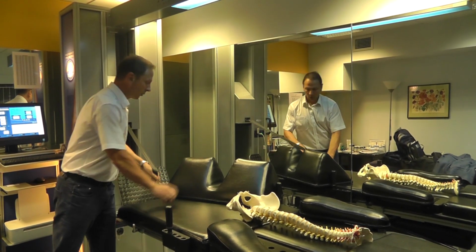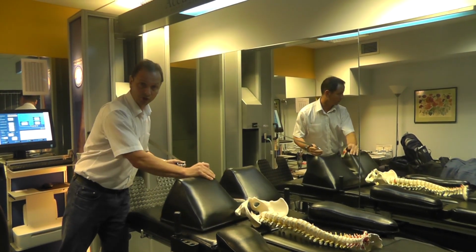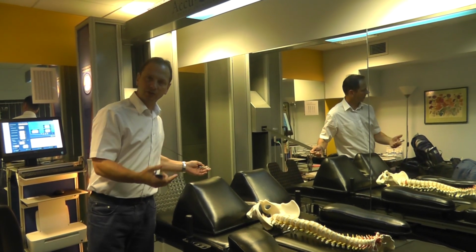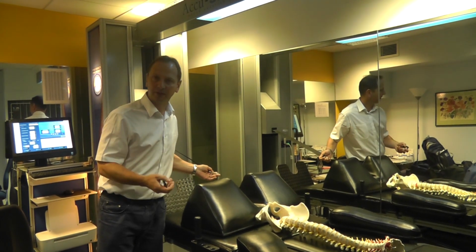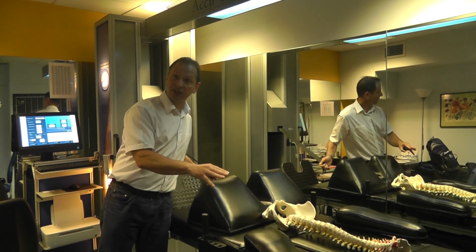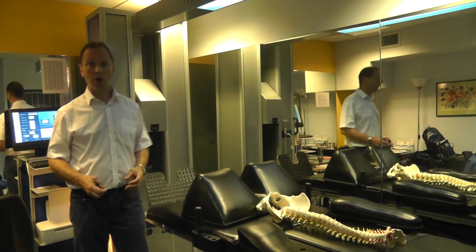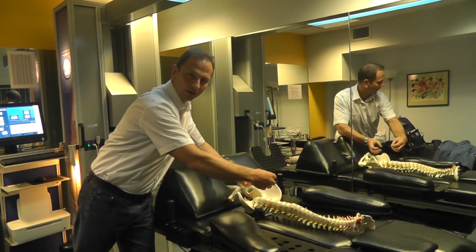The patient's very comfortable. We apply forces of half up to and over half a patient's body weight, which is considerable, and there are factors which determine why the forces are applied comfortably, so the patient is completely relaxed throughout the treatment. They're lying on the machine for 25 minutes. There are 13 cycles of 1 minute where the joint is opened and then mobilized.